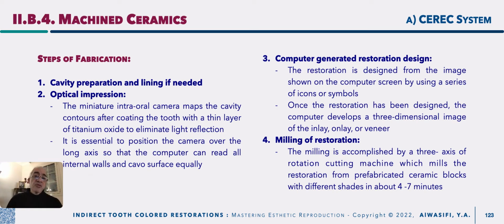But older versions may need you just to trace the margins and design your restoration manually. Finally, after complete satisfaction of the operator by the design, a command is given to the milling machine to start milling in 3 axes and 3 dimensions of your restoration from a ceramic block.